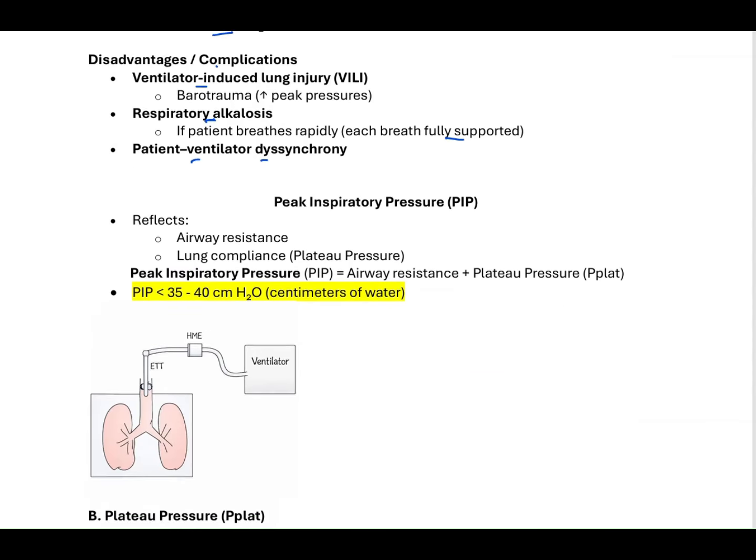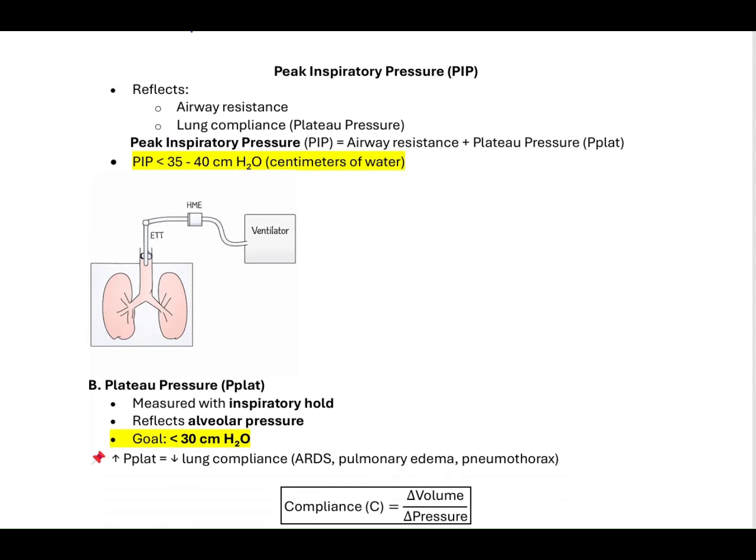So now let's focus on peak inspiratory pressure. When you rotate through the ICU, or when you work in intensive care units, at some point they might call you about elevated peak inspiratory pressure. So what are you going to do about it, right? Let's talk about it.